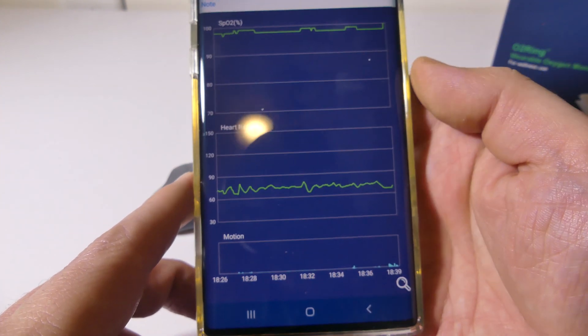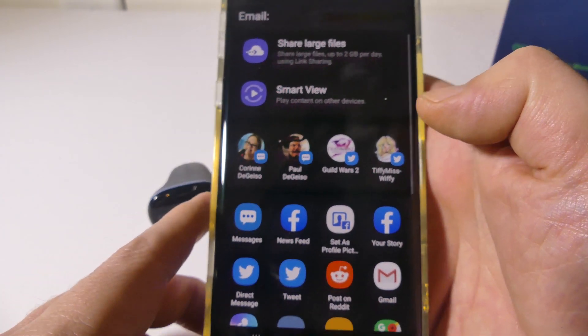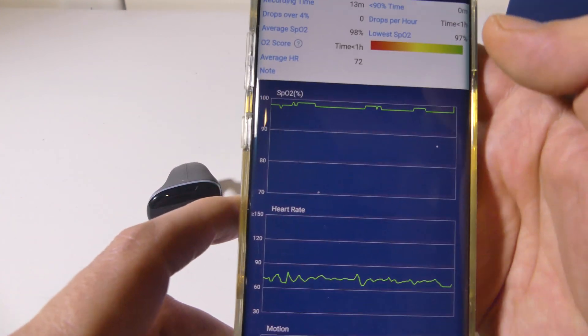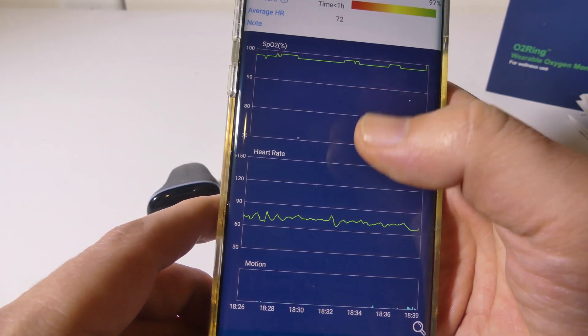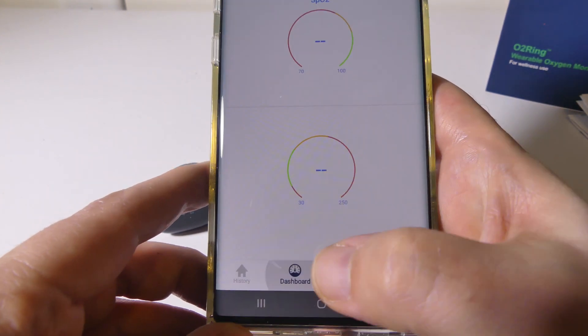There's also motion data at the bottom, so if you're wearing this while sleeping, you can see how much you're moving around. You can share the data with other people, share it to Facebook, save it as a file, and give it to your doctor to show what has transpired over time.